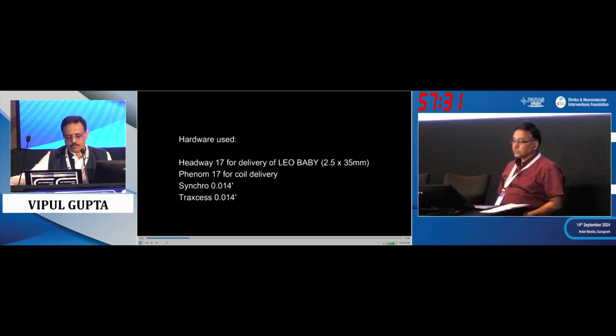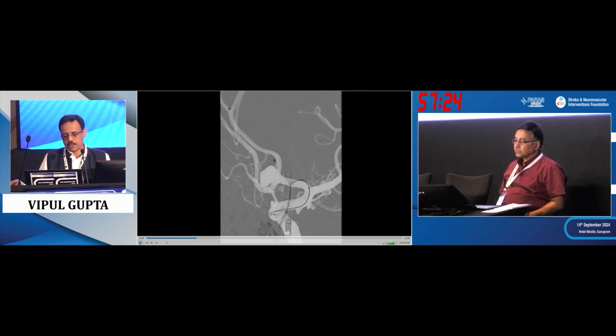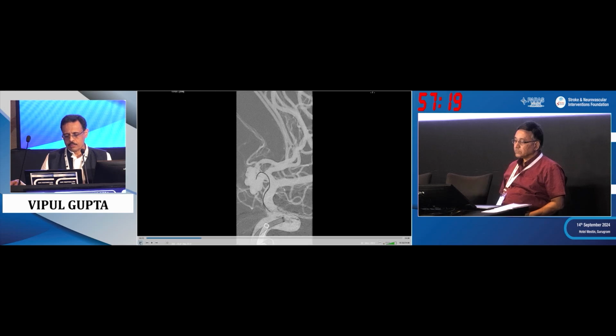So we thought maybe stent will be a safer choice here, or at least a long-term practical choice here. And so what we do usually, we use a single stent, but we use sort of a shelving technique to open it up. And that's the coiling micro. I think it was Phenom in this patient.